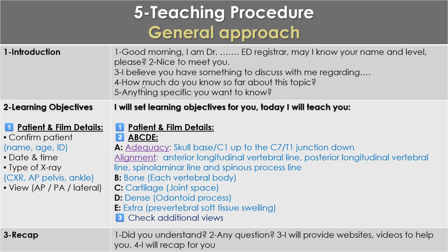Okay, so you have two open questions. How much do you know so far about this topic? Then stop. Anything specific you want to know? Then I will set learning objectives for you. Today I will teach you the patient and film details, then ABCDE approach, and then check additional views. Easy? How many learning objectives? Sir, 4, I think, sir. Three.